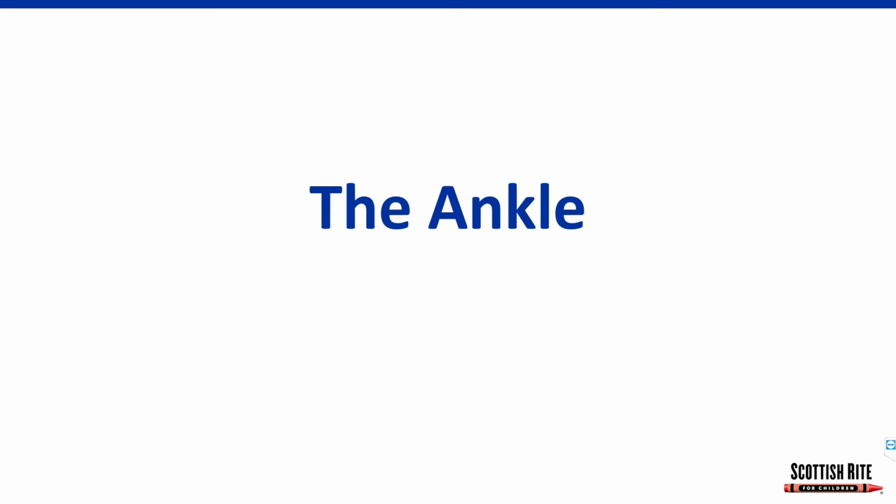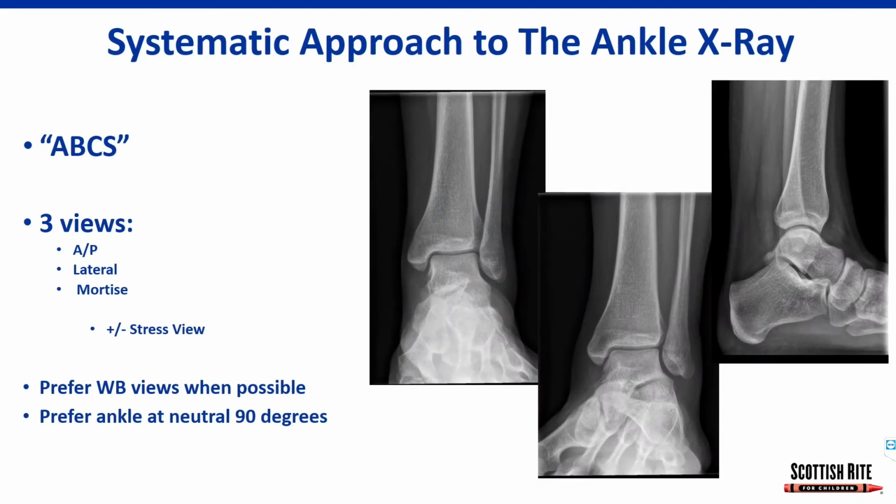I think some of those are applicable for pediatric patients. They're certainly more applicable for our adult and adolescent patients. But in pediatrics, sometimes there's just not enough of that developed yet for you to use those same measurements. But nonetheless, I think it's still important to evaluate them. And obviously, in our older adolescent patients, we want to make sure we know what we're looking at and really more about what it represents.